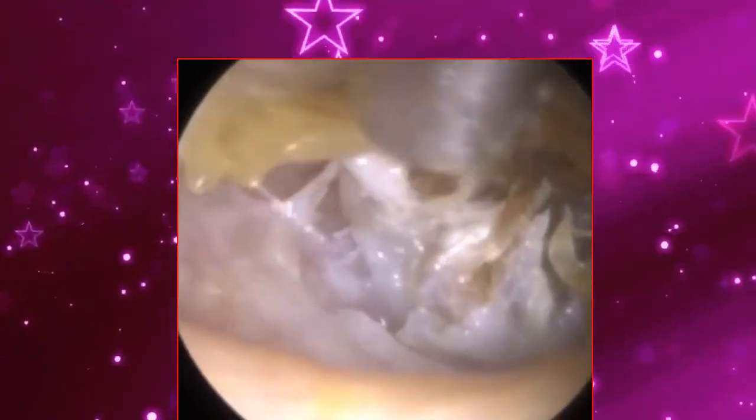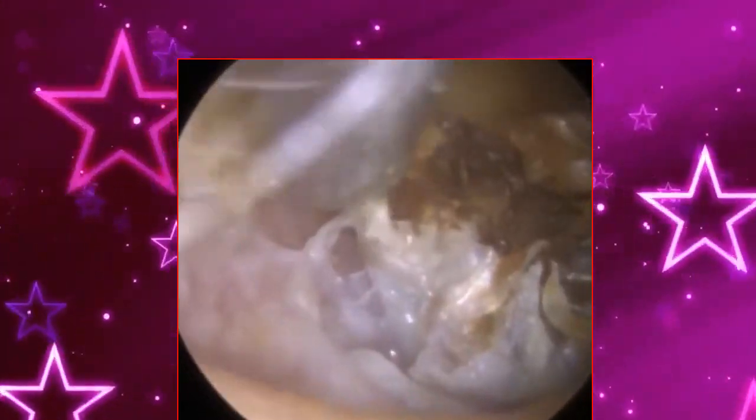So probably about half of it out. I'm just trying to remove it here off the anterior, the front part of the ear canal. You can see the skin layer there, so I'm giving it a good wriggle and a tug. I'm at the base of the ear canal. You can see that fresher layer of dead skin forming, the whiter layer on the right where I am now, slightly older, it's more pale yellow. I'm really working this off the back part of the ear canal. It's really strongly adhered.